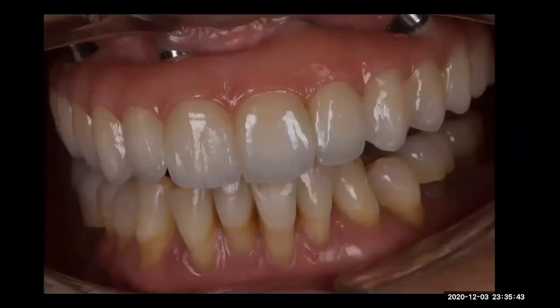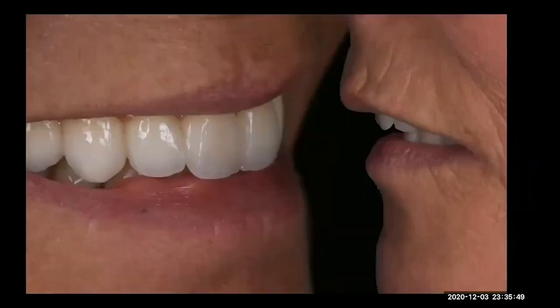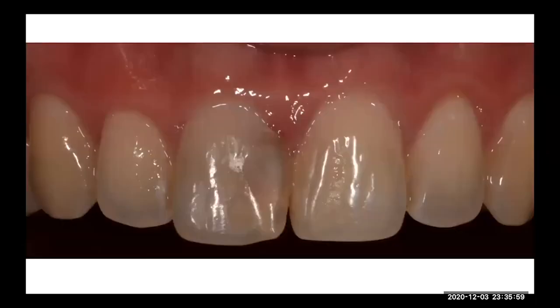Okay, this is another view of the picture. This is the restoration, some different movement, different positions. Teeth look individual. Okay, but let's say making a big case is not easy, but it's less hard than making a single crown.